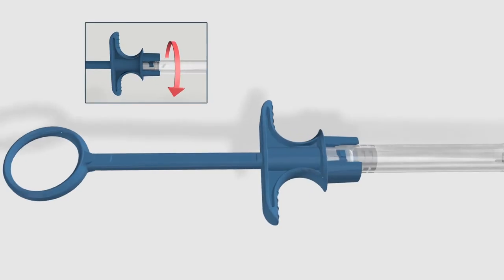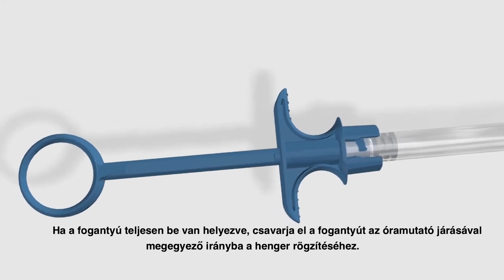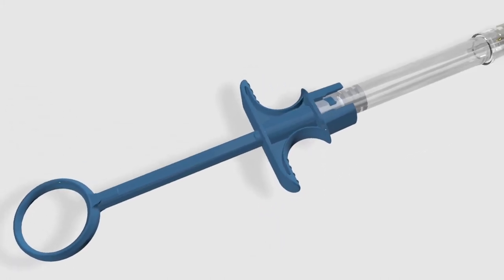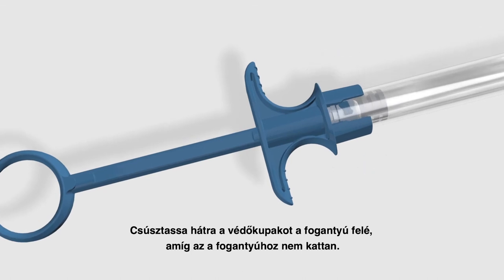Step 3: when the handle is fully inserted, twist the finger grip clockwise to lock the barrel. Step 4: slide the protective sheath backwards towards the handle until it locks against the handle.